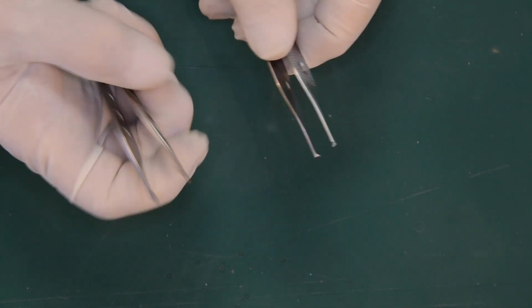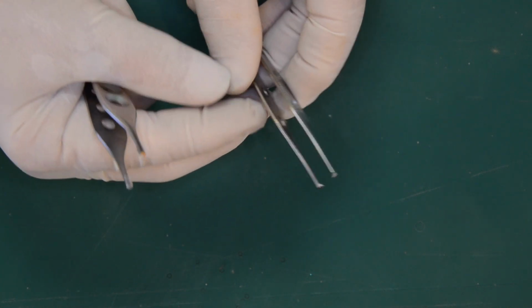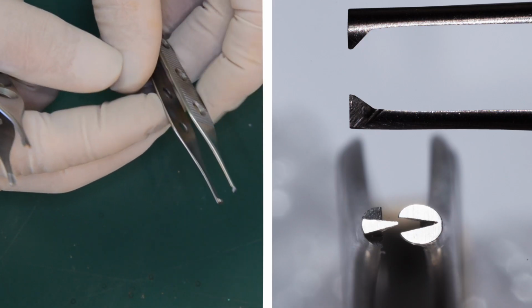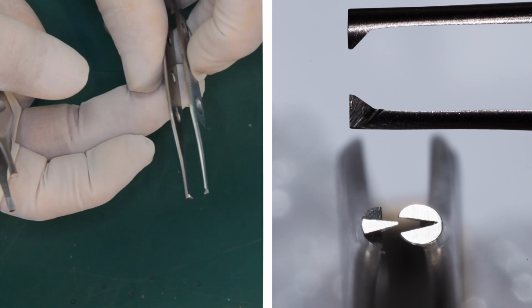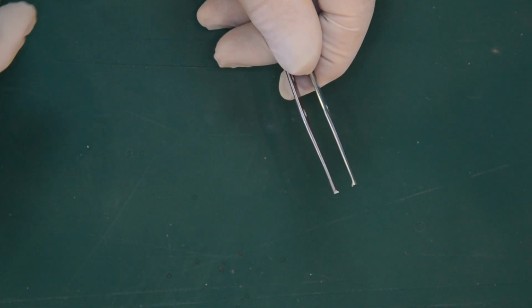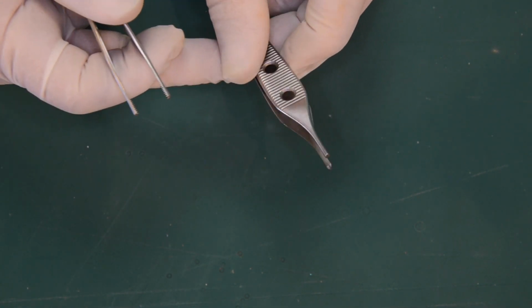You can see with a typical Adson type forceps that has 3 sharp teeth, when you go to squeeze the tissue, it's very easy to perforate the tissue, and as you do that, you're again affecting the blood supply. And as we've talked before, the blood supply is what we really want to maintain in all aspects of how we handle tissue.